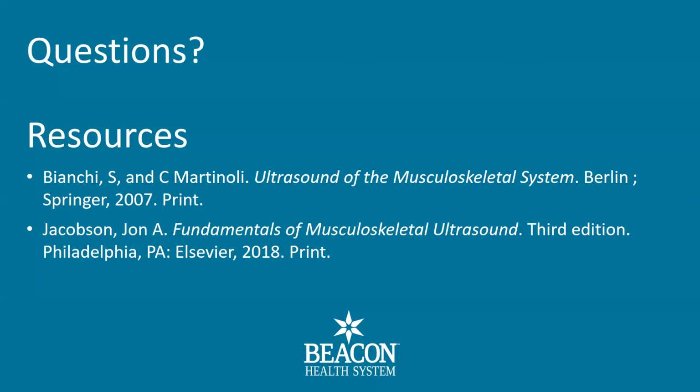In this scenario, I still will do diagnostic injections for the Pes at this area, even if I don't see a lot of bursal distension, just to rule it out for these patients, especially if there is other underlying pathology that they're still questioning. But I would 100% agree that I very rarely see any type of true bursitis in this area. I see Brennan, Ryan, you're on. Do you have a similar experience?